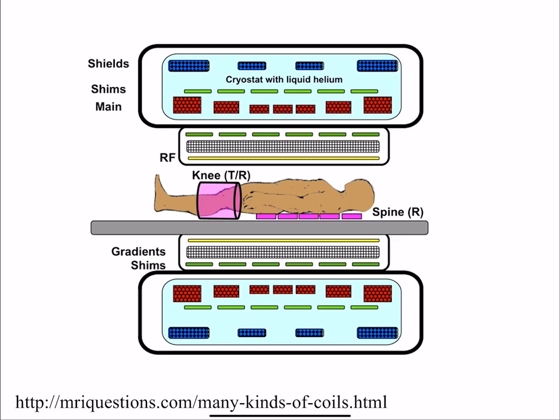But let me give you guys a thought experiment. Let's say I came into the magnet and I had this in my hand, like, I just wasn't thinking. Let's say this is me and I'm standing here holding my water bottle, and let's say I'm 1 foot away. So this bottle will be ripped out of my hands, and it's going to go flying into the magnet.